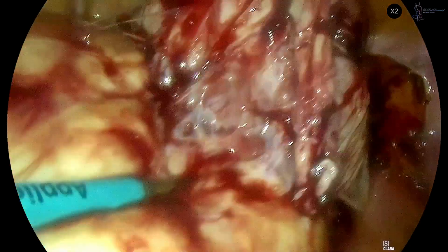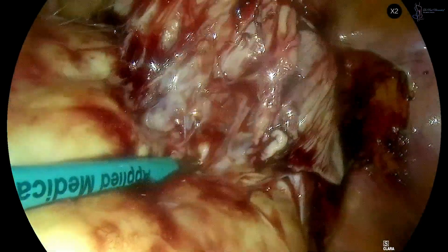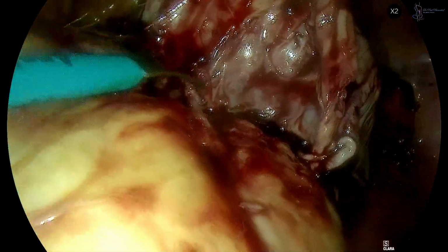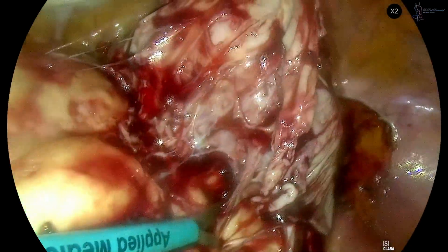Once the myoma is adequately mobilized, it is gently shelled out using a combination of traction, countertraction, and hemostatic measures to minimize bleeding. Care is taken to identify and coagulate feeding blood vessels to reduce intraoperative blood loss.